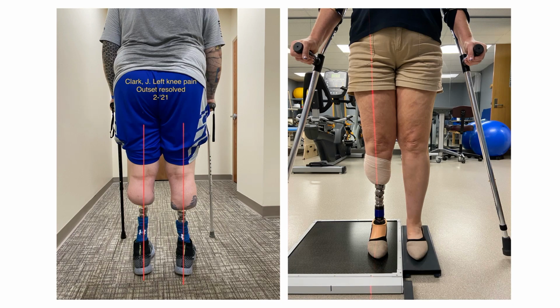If you saw Jeff Cain's x-rays, didn't you think that was kind of wild? But his feet were anatomically placed under his hip and his knee, and that's what we're looking for. And we like to use the laser posture for this. The Australians truly believe in this. With this laser posture, you want the load line to the lateral pole of the patella, using the laser posture 2D.